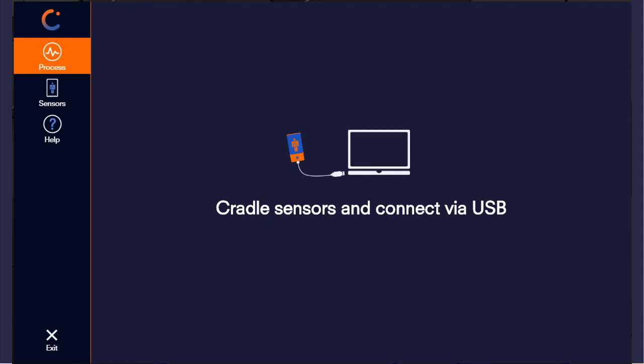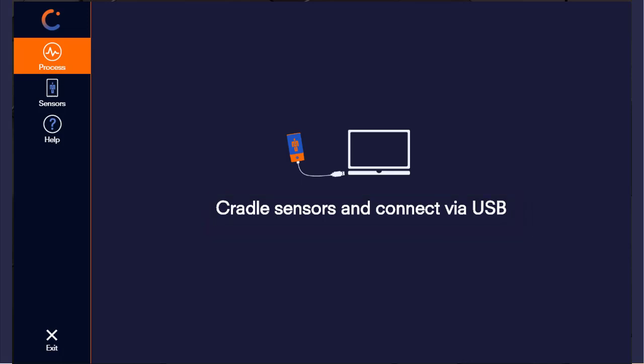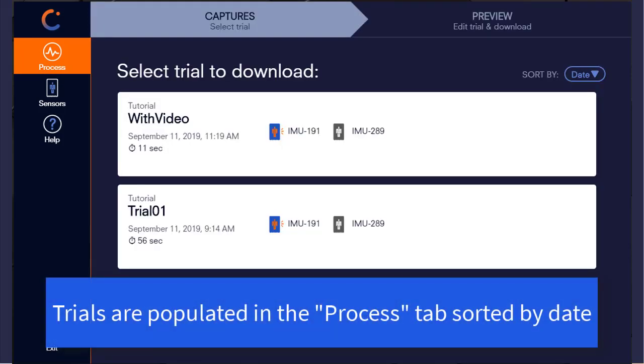To begin using CaptureU Desktop, please cradle your Vicon Blue Trident sensors. When complete, you will see all trials populate within the list of trials to download, sorted by capture date in either descending or ascending order.